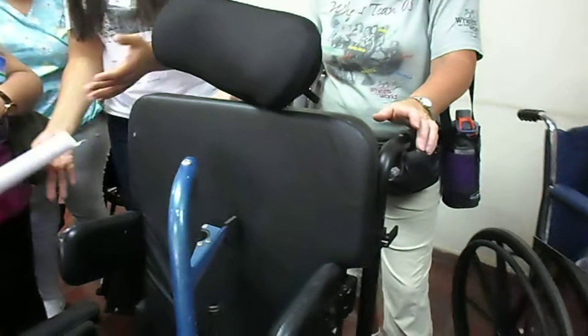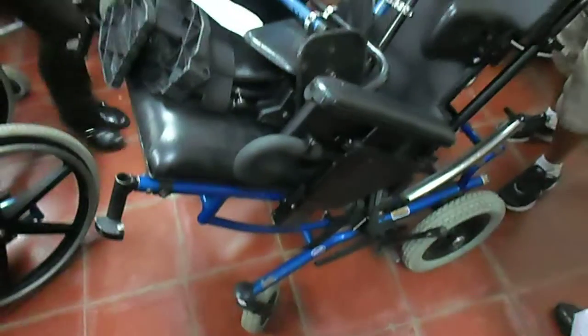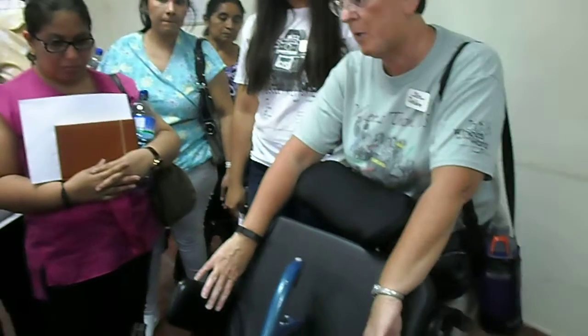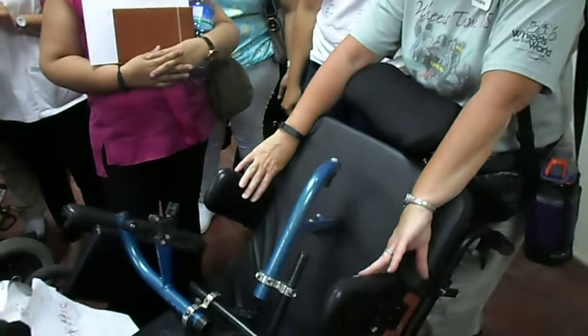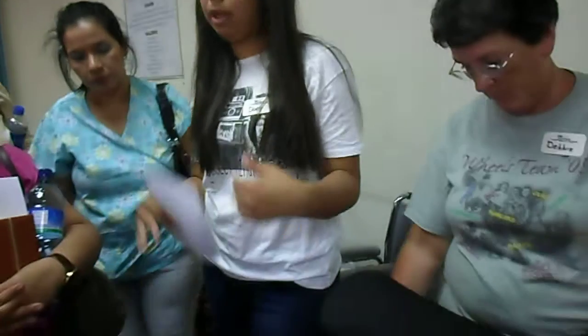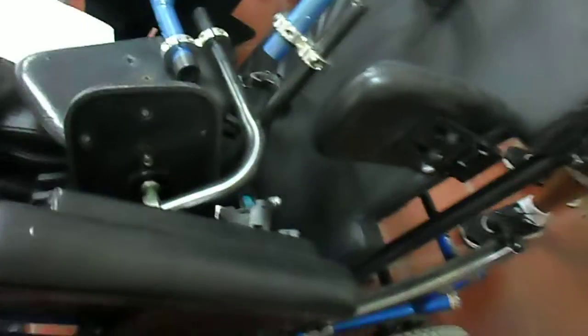Dice que este también es reclinable, que no solo el respaldo se hace para atrás, sino que toda la silla de ruedas se hace para atrás. By doing this we can recline the entire mechanism. Of course it's got a head support, it's got lateral support. This is a need for someone who has a lot of neurological involvement and needs lots of support and cannot maintain posture. Esto es para una persona que tiene bastantes problemas en cuanto al soporte del cuerpo mismo, porque para personas que no se pueden mover para nada.